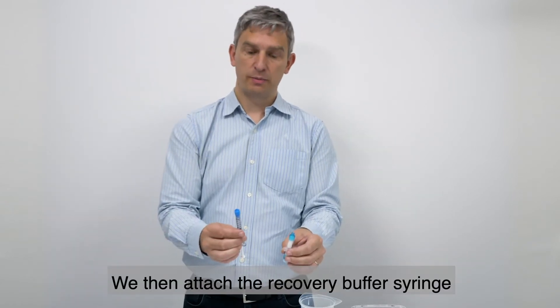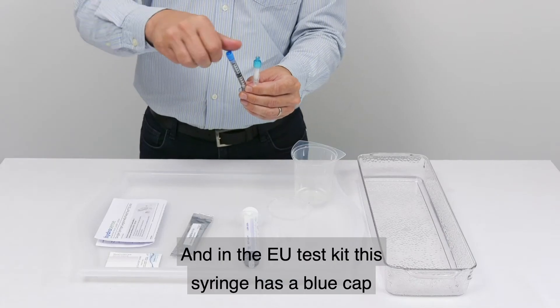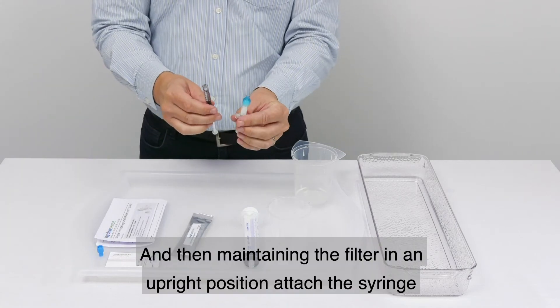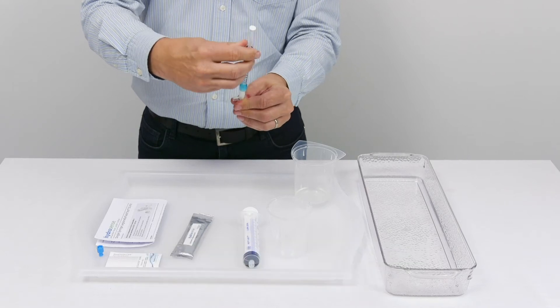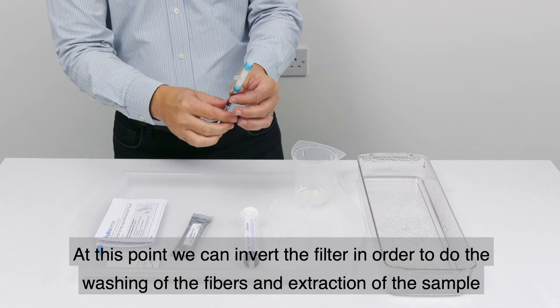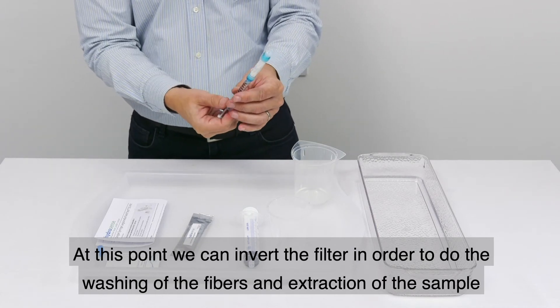We then attach the recovery buffer syringe — in the EU test kit this syringe has a blue cap. We remove the blue cap and then, maintaining the filter in an upright position, attach the syringe. We can then invert the filter in order to do the washing of the fibres and extraction of the sample.